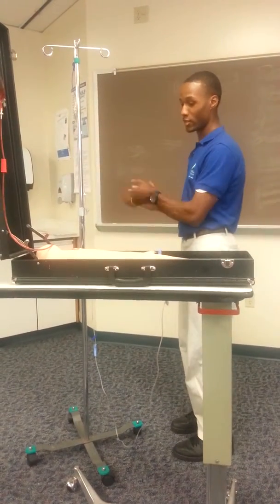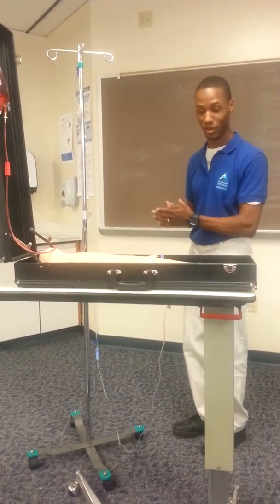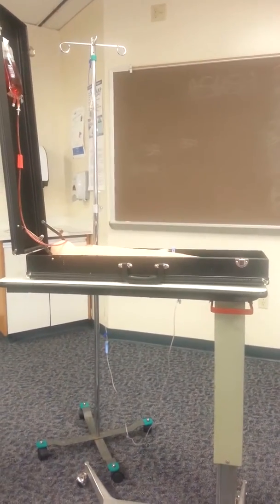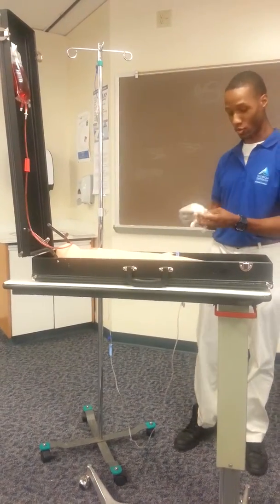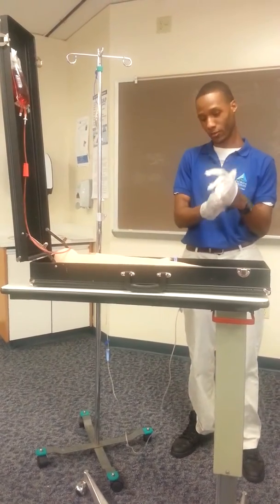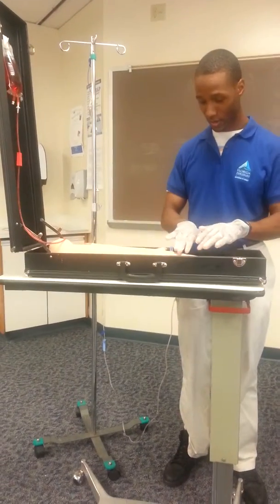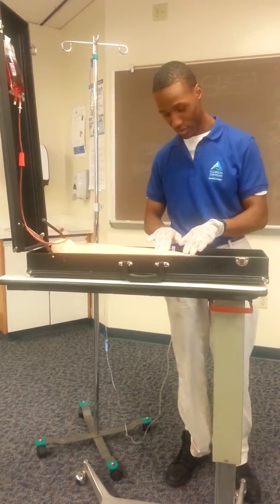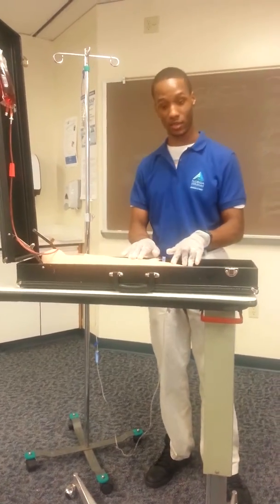I will then perform hand hygiene. I will go in and proceed to put on my gloves. While doing so, I'll explain to Mr. Johnson that the doctor has ordered Zosyn, the Piggy bag, to be going in over the next hour. I will then assess the patient's IV site, and I will assess for bruising, swelling, edema, coldness, heat, any discomfort. The patient has stated none.